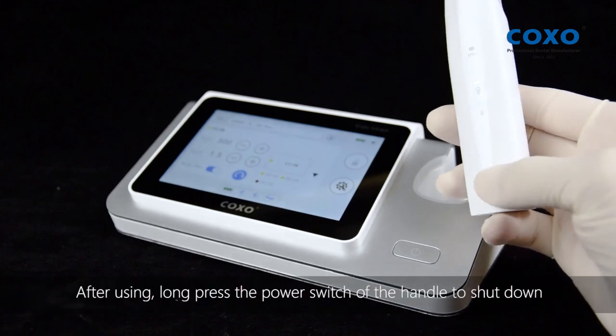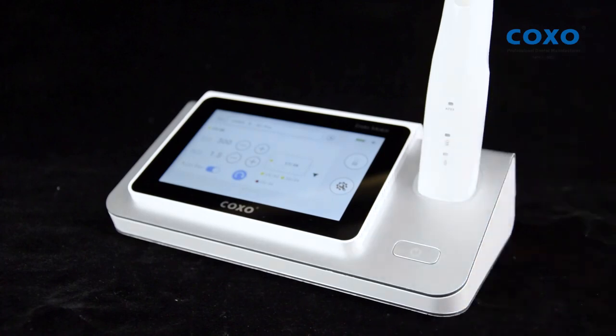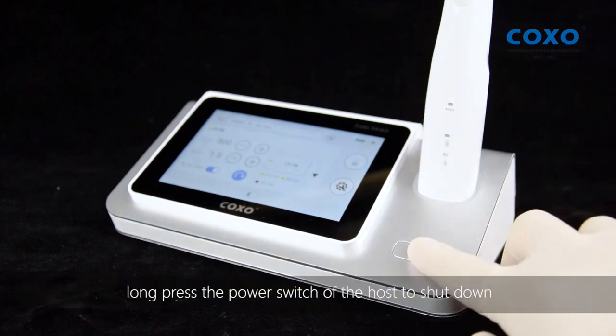After using, long press the power switch of the handle to shut down. Long press the power switch of the host to shut down.